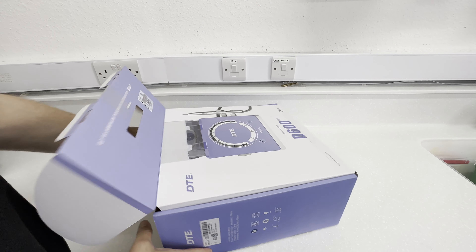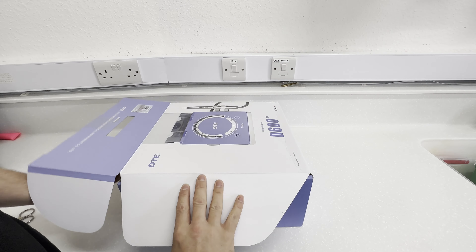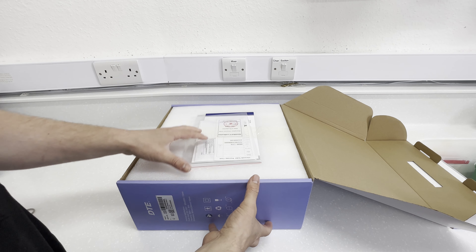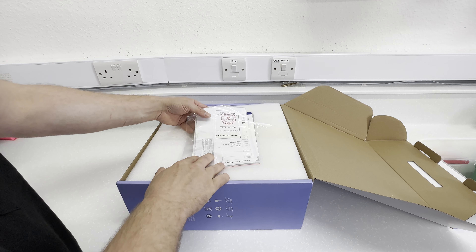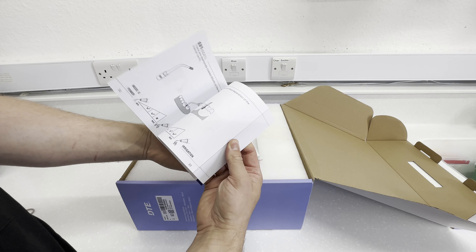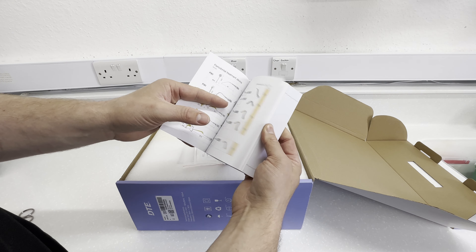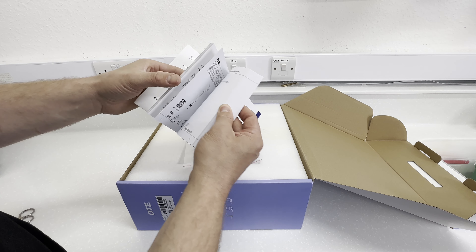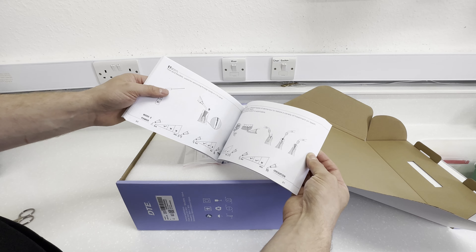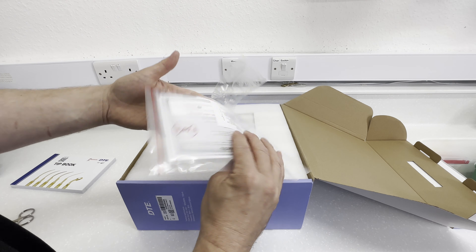It opens up like so — if you're going to keep it in the box that's quite a nice lid. When you open it up you're not pulling it out from the side. First what we've got is a tip book — I like this — it shows all the different tips that Woodpecker do, and then a sort of instruction manual for each tip as well, which is fantastic. I've never seen anything like that before. And we've got an instruction manual too.